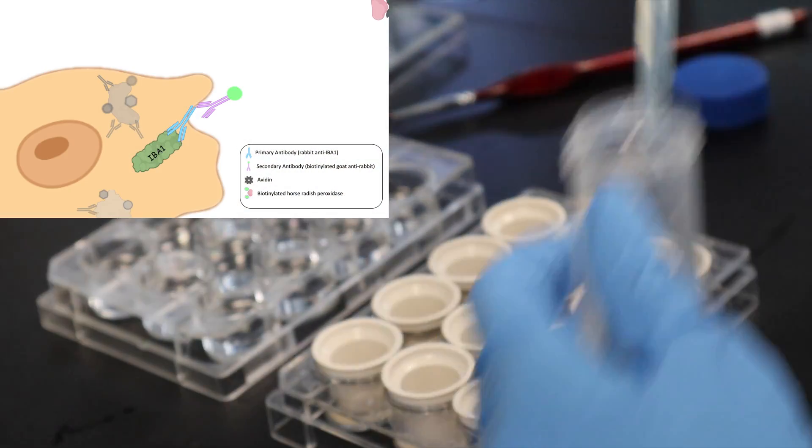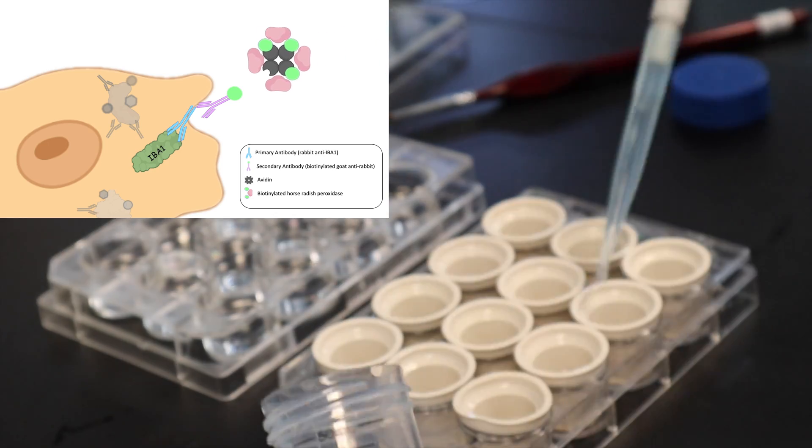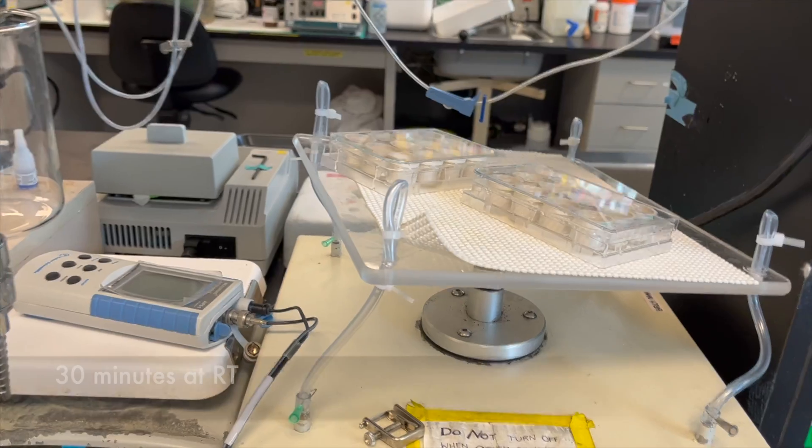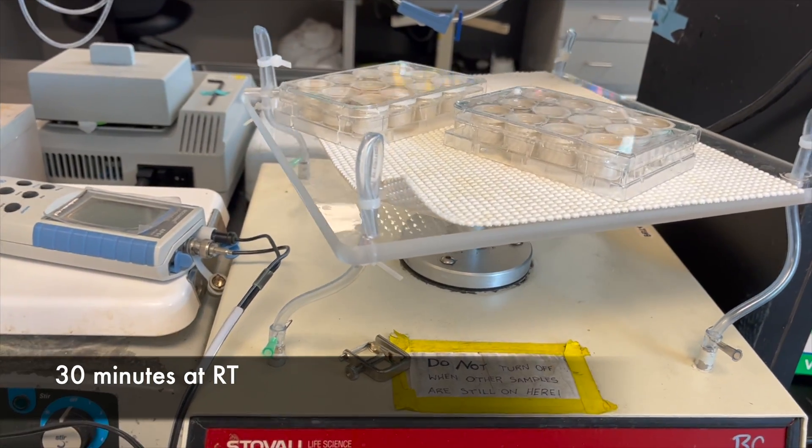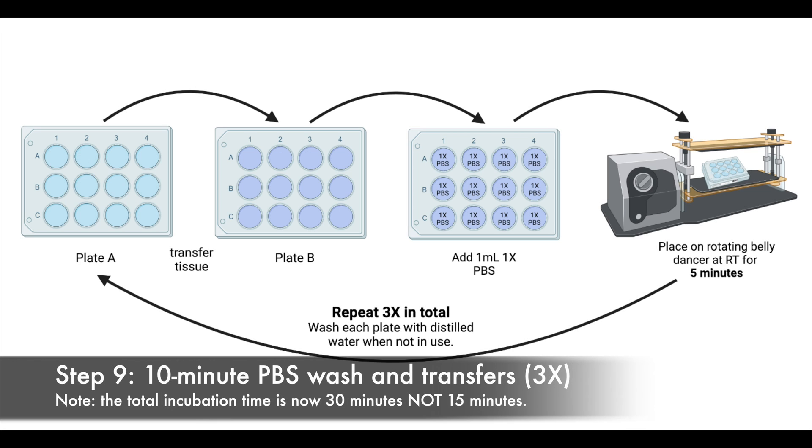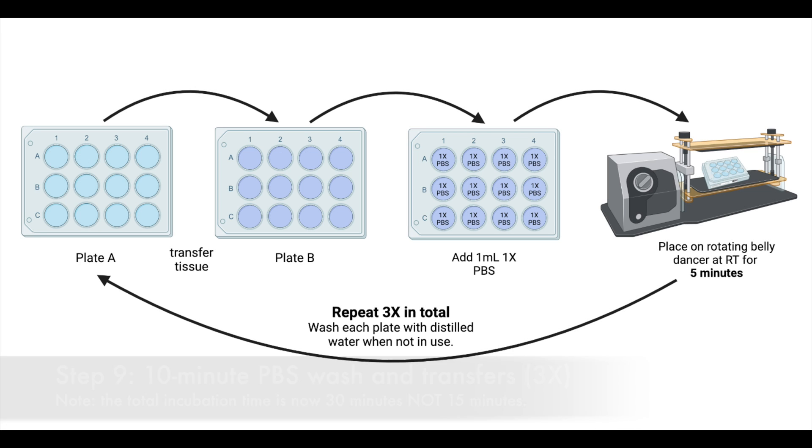Once ready, add 1 milliliter of ABC complex solution to each well in a new plate and then incubate the sample at room temperature for 30 minutes. Next, complete another set of 10-minute PBS wash and transfers.